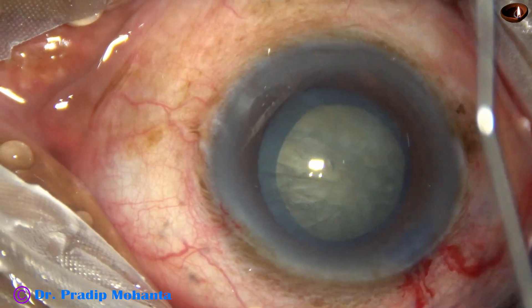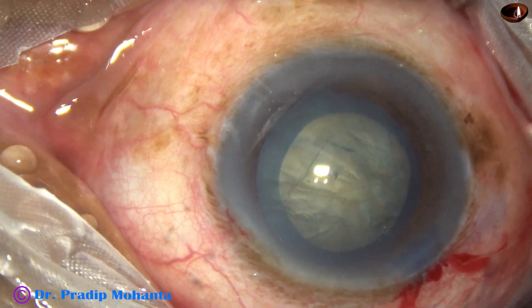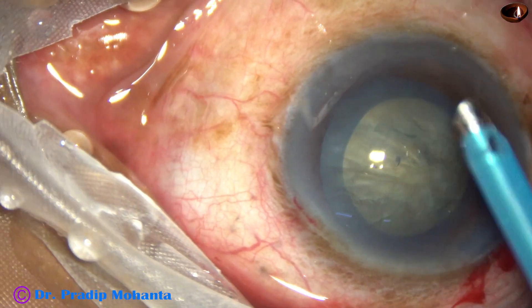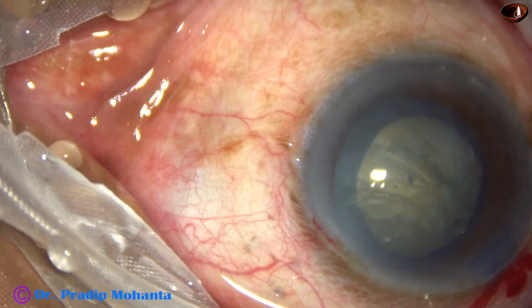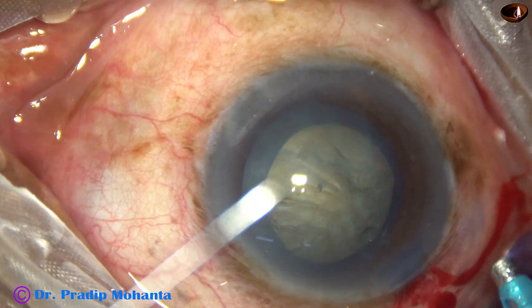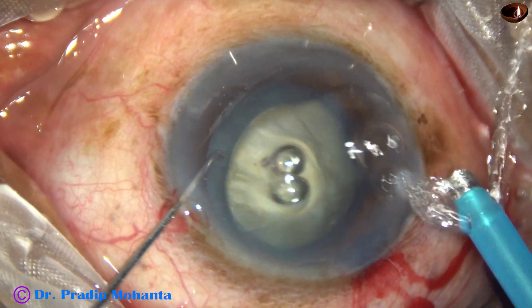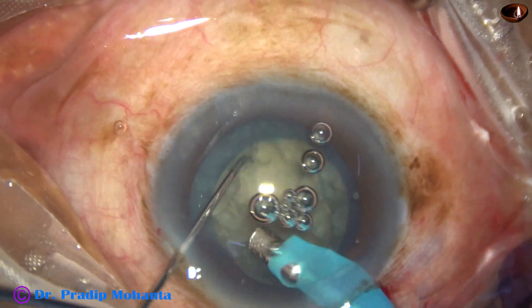And now, it is time to fill up the chamber again with visco and introduce the phaco needle. The phaco needle goes in with its bevel down. Some superficial lens matter is removed.